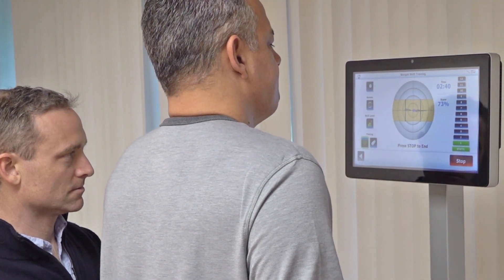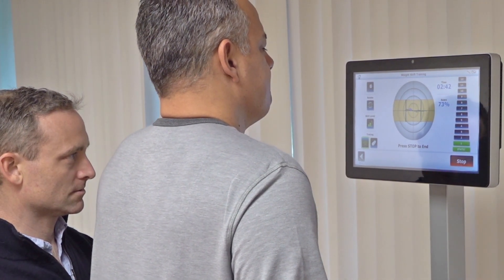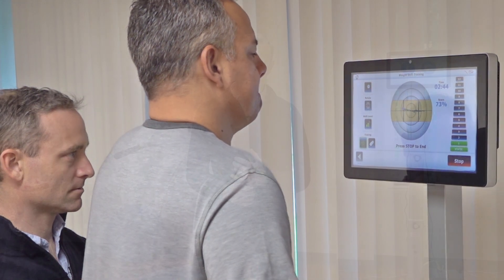As you progress to varying directional movements and changing surface stability, increasing activity time with various training modes can also help increase strength, endurance, and movement.